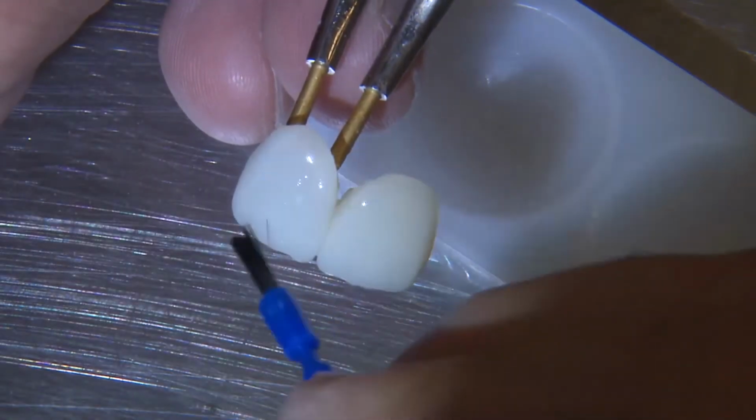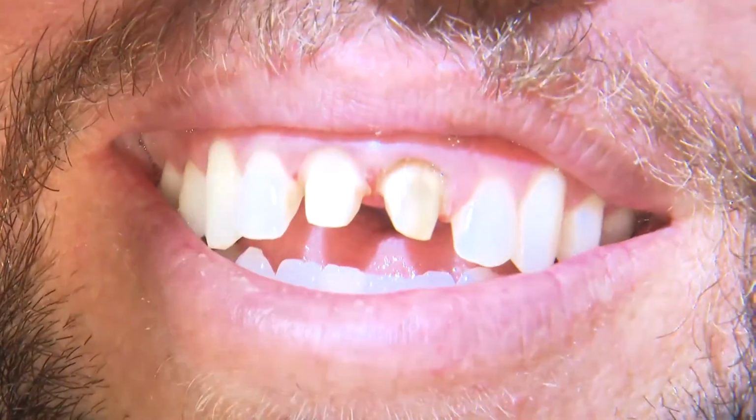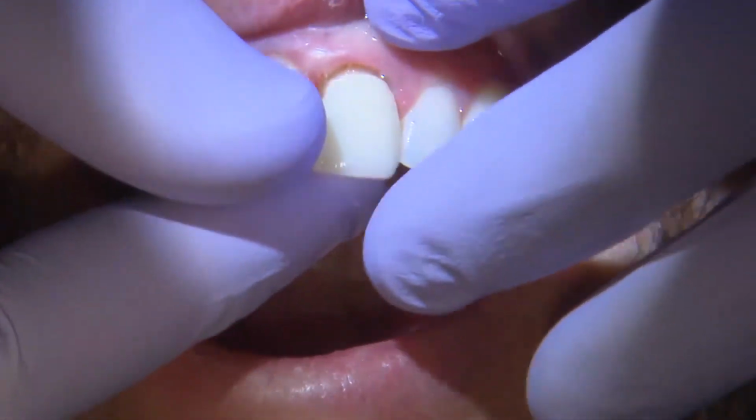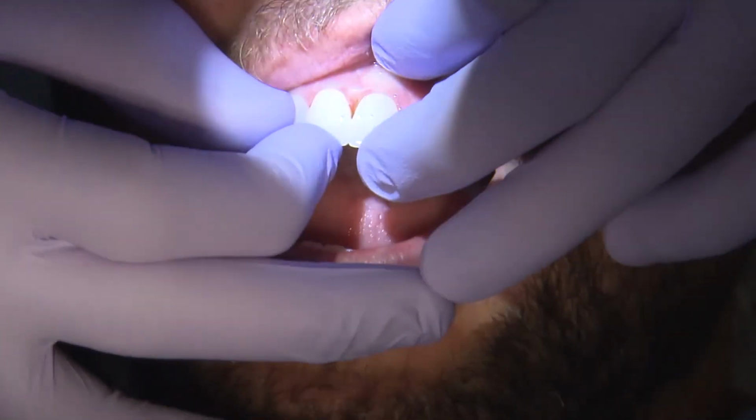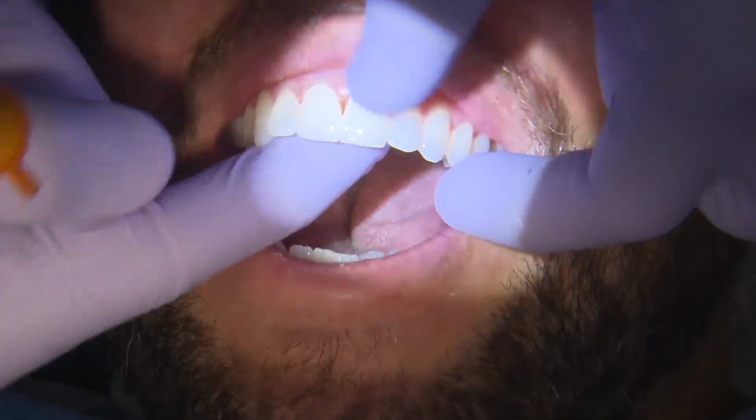Now, what I'd like to do is try them on first before I place the cement, so I want to try them on and make sure that they fit properly. Then I'll take them back off and dry them, and then load them with temporary cement before delivering it in the patient's mouth.